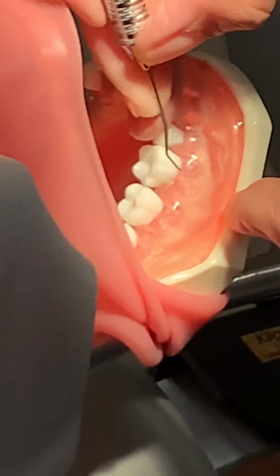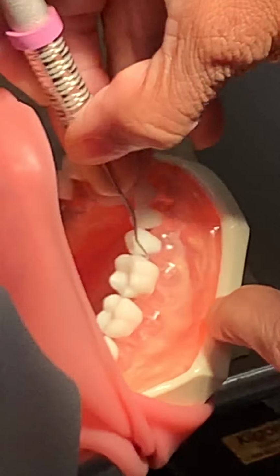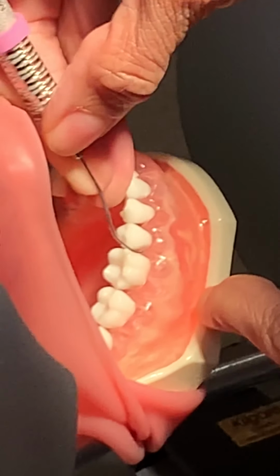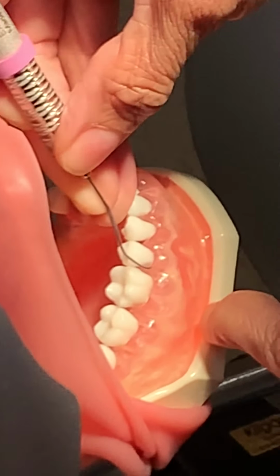is still adapted. Go back to the distal line angle, premolar, rocking off my fulcrum, going all the way in a proximal. Come back to the distal line angle, going all the way here, going in a proximal, keeping my terminal shank as parallel as possible.